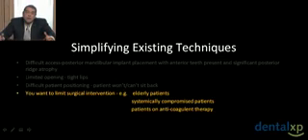Another more significant area that's becoming more and more common, at least in my practice, is the management and treatment of elderly patients. With computer guidance, we can limit the surgical intervention. There are many procedures that we can perform on a patient, but it might just take too long, and the patient may not be able to tolerate the length of the procedure.